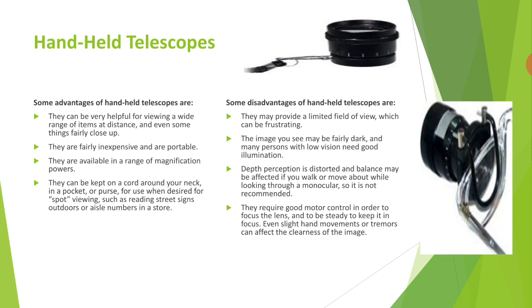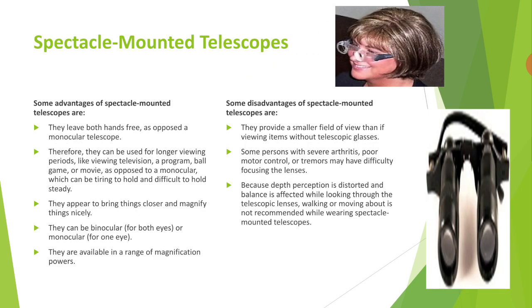So please always note, guys, monocular telescopes also come in clip-on versions, so they attach to the patient's eyeglasses frame and leave both hands free. This hybrid telescope can be used for one eye only for long periods at a time. Okay. Next, we have a spectacle mounted telescope.